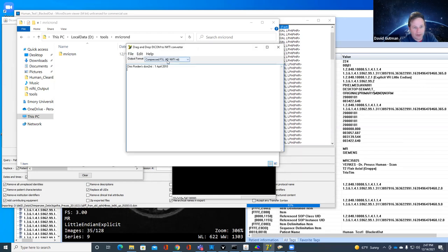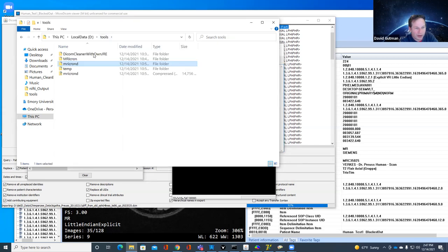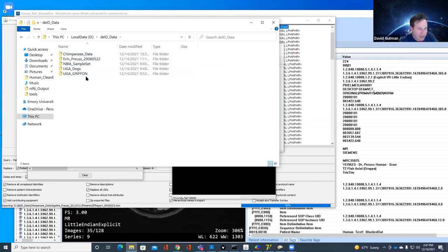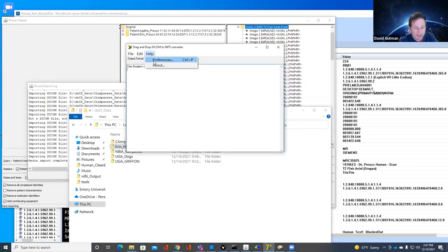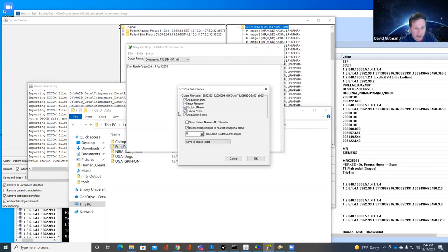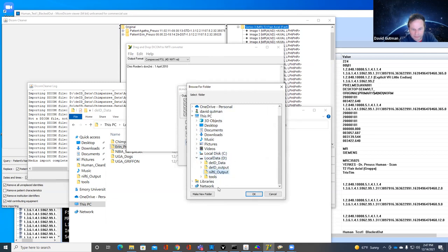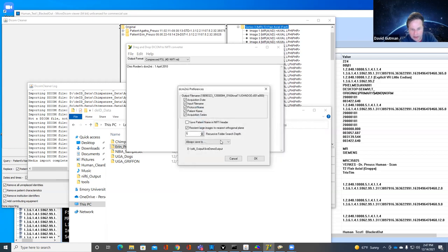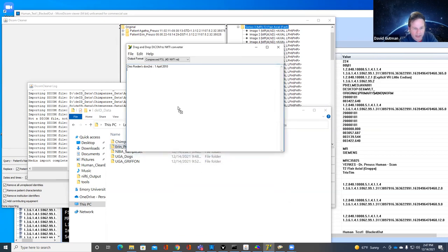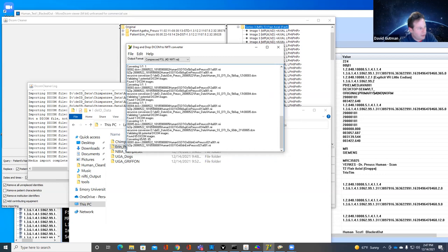I opened up this drag-and-drop DICOM to NIfTI converter. You can see this is the April 2010 version. On Windows I'm happy with what I get. I'm going to take the same scan I just showed you, check a couple of options — probably don't want acquisition day in the output filename — choose where to save it, make a new folder called 'live demo output,' and hit OK. It would be difficult to be much easier than that.